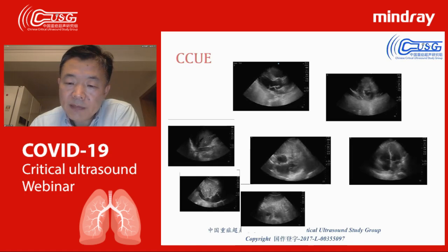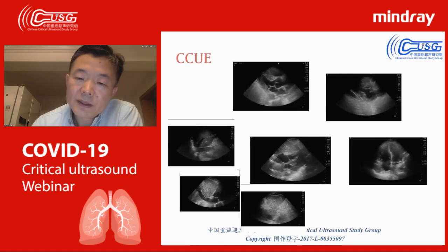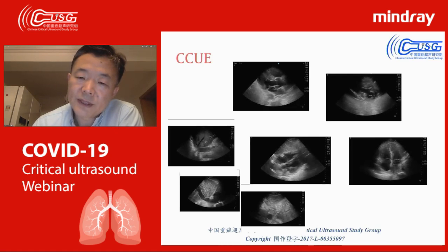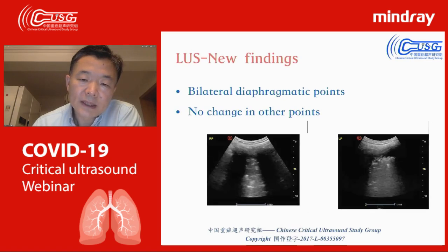And the right ventricle is enlarged. So we see all these things, and also you can still see in some part of the cardiac cycle the D shape. And so they also did the lung examination.